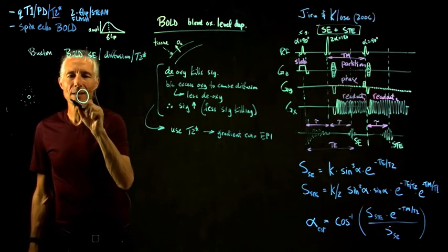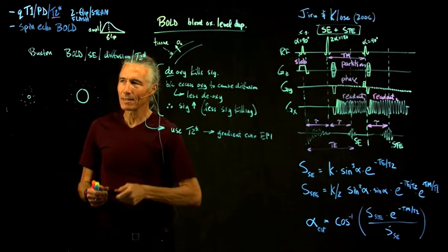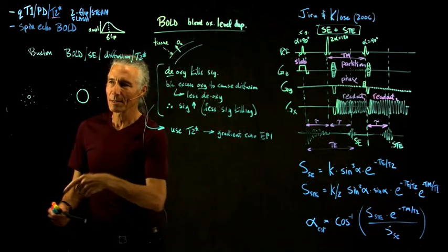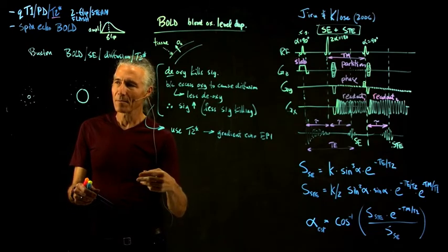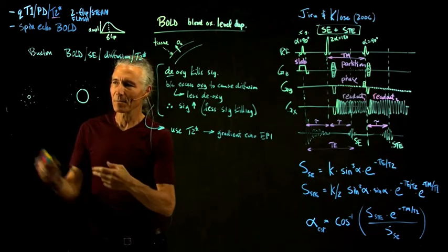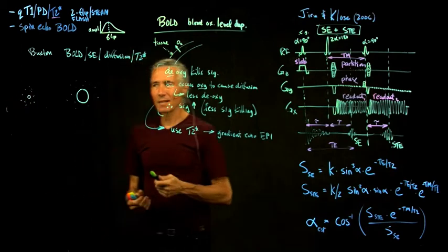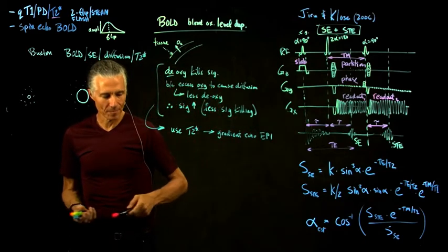We don't really care about what's going on in the tissue right around the big blood supply because that's probably going somewhere else. If the blood was going somewhere else, we might misattribute the signal from that blood that was actually designed to be taken up by the tissue in a small capillary somewhere else. So we would like to select for the tissue around the small capillaries.